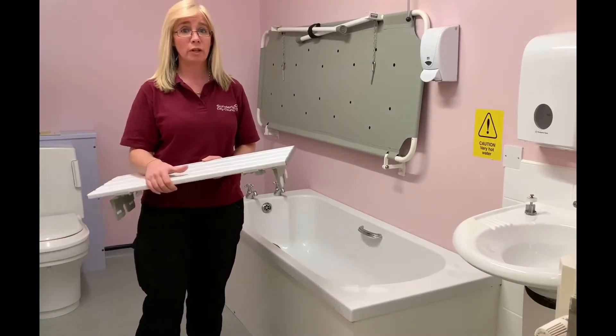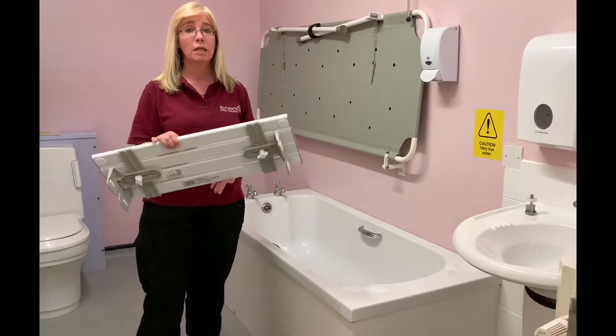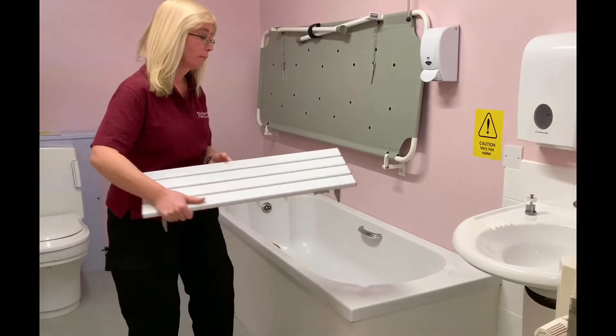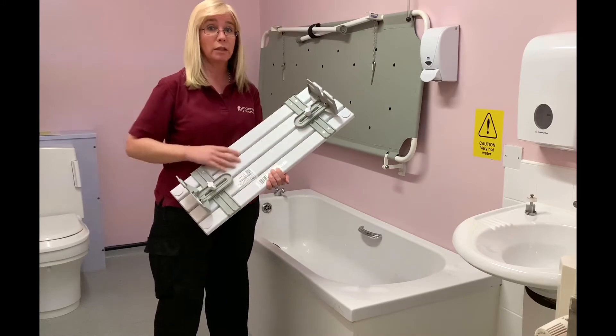If you have an over the bath shower and have difficulties transferring your legs over the edge of the bath, a bath board would be a suitable piece of equipment to try. The bath board can be adjusted by using the little screws underneath.